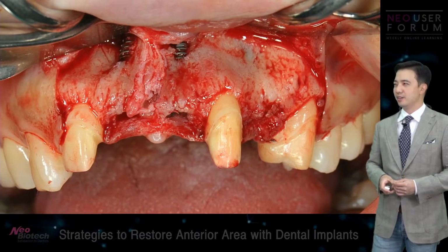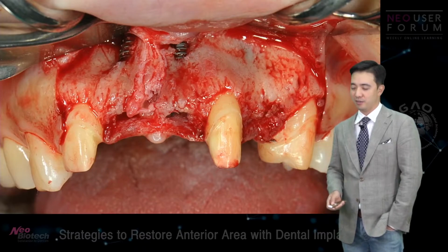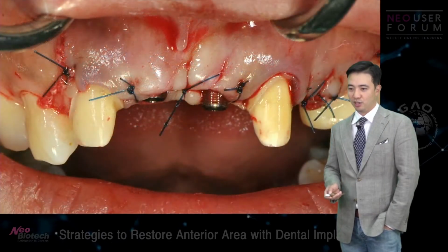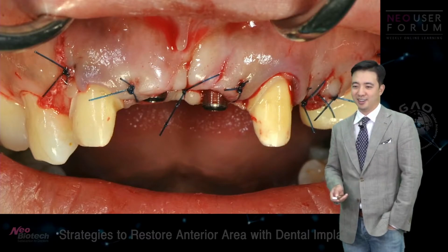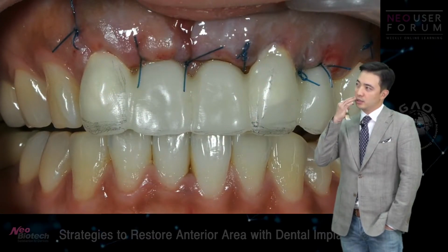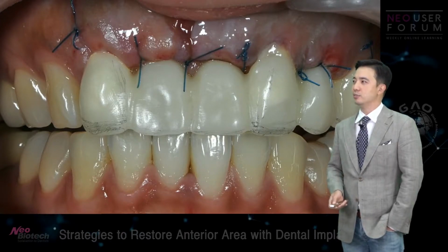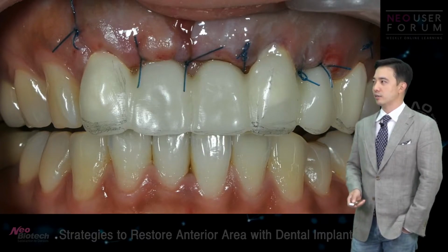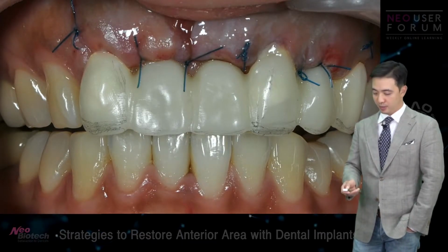I was so brave, I think, that I just went in. Okay, I'm just going to GBR the heck out of it, and then I added a lot of bone, sutured, and I thought, I'm the best surgeon in the field, but yeah, I didn't really know. Or I think I knew, but I was too optimistic, I would say, to do this kind of brave surgery, because you'll see what's gonna happen next.